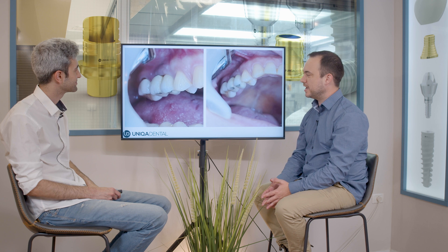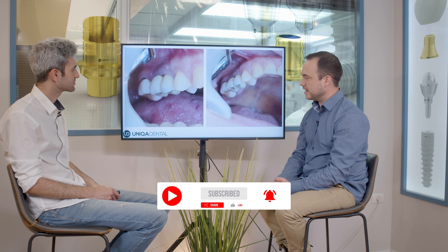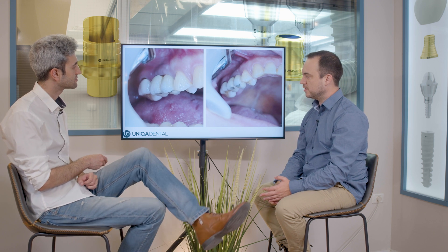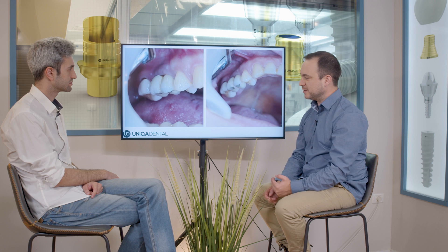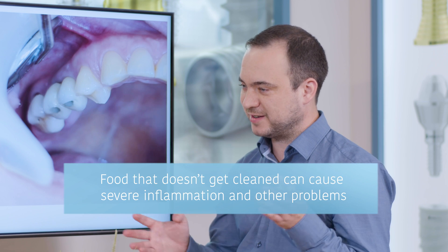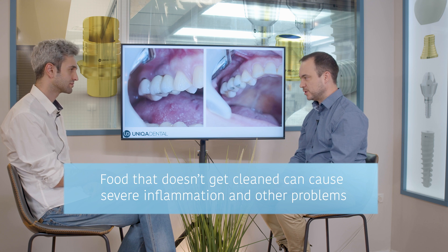Today we have a case of two crowns on two implants. We want to show a couple of things. First of all, there was some inflammation around the crowns and the implants because food got stuck between the crown and the gingiva, and the patient didn't clean it in time. So the gingiva inflamed and grew around the piece of food that was stuck.